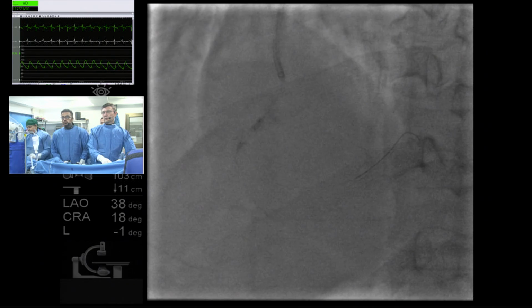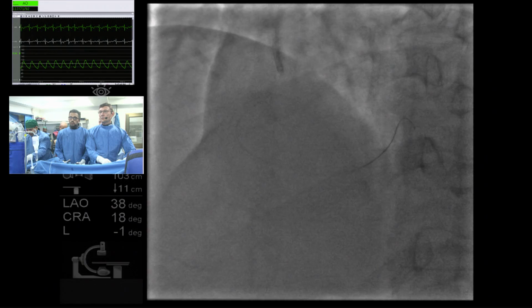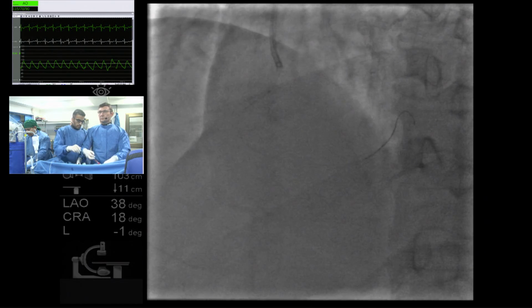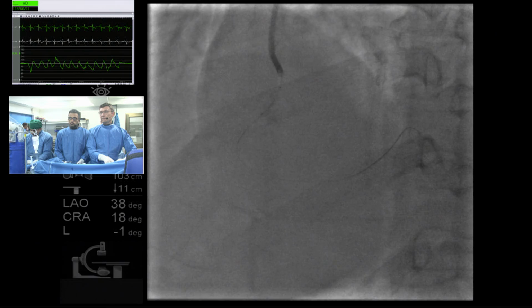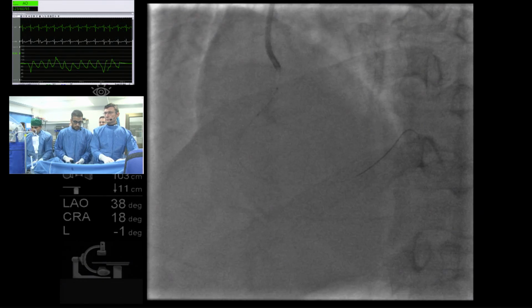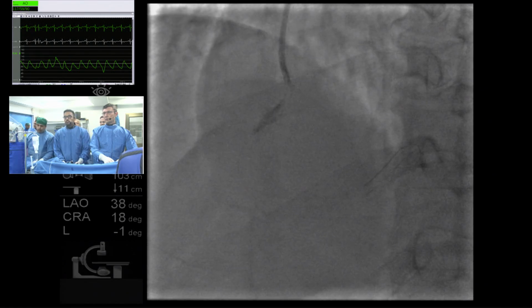If we use the longer diameter, it may be a mistake. Do you think in RCA it overestimates OCT? No, it's tortuous. It's not very perpendicular. Not so tortuous. I think LAD with hypertension is sometimes very tortuous, right? So is it safe to say that when in doubt, use the shorter diameter? 8, 10. Yeah, go to 14.